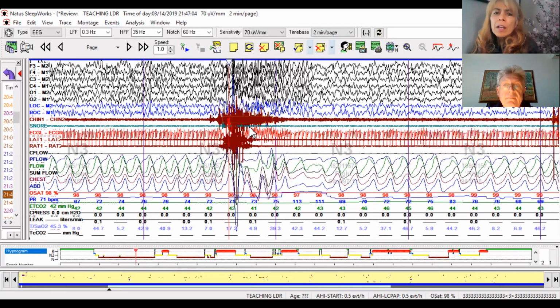So can you make a comment about large muscle group movements that were previously only scored as arousals, but the movements were not really identified? This would be one of those that would be scored as a movement associated with an arousal? Yes, exactly. But not all movements are associated with arousal, especially in children. So it is not the same as scoring arousal. Right. You can have arousals without a movement.